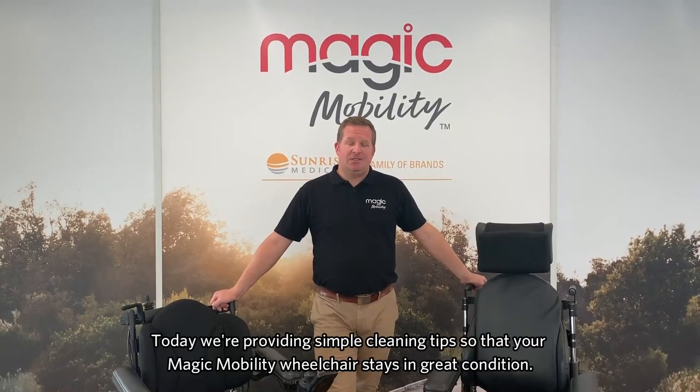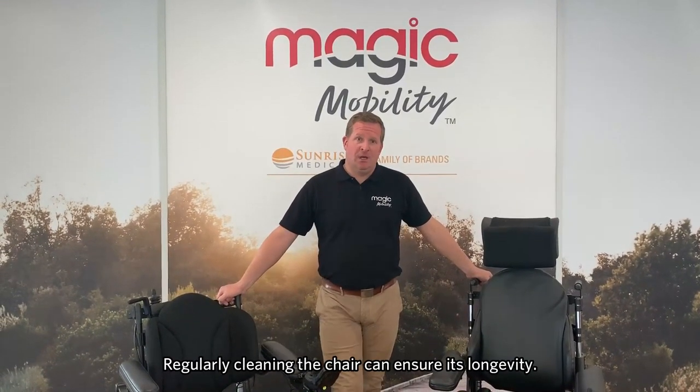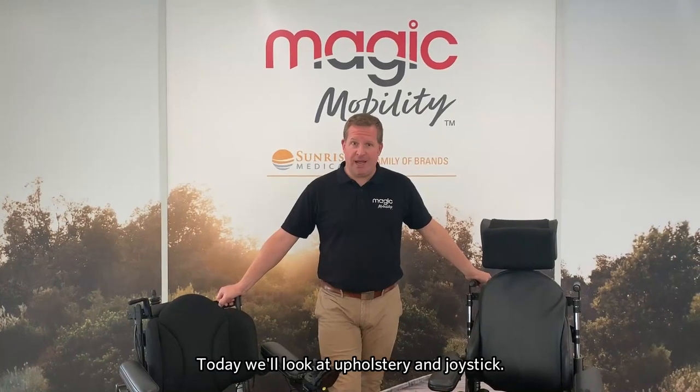Hi, I'm Scott, one of the rehab engineers here at Magic Mobility. Today we're going to go through some simple cleaning tips to ensure that your Magic Mobility chair is kept in great condition. Regularly cleaning the chair can ensure its longevity, and today we're going to go through the upholstery and the joystick.